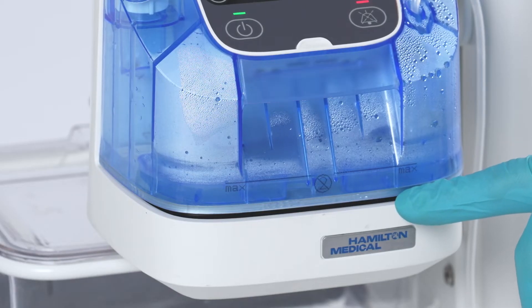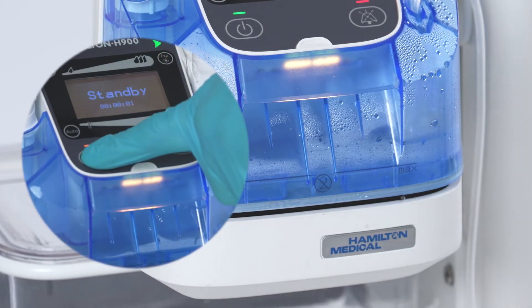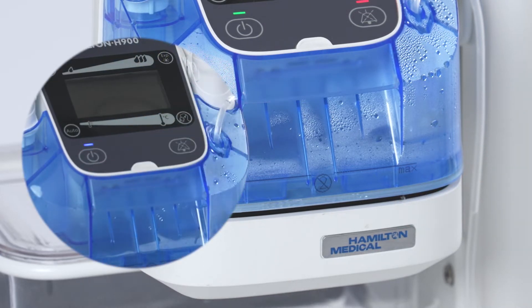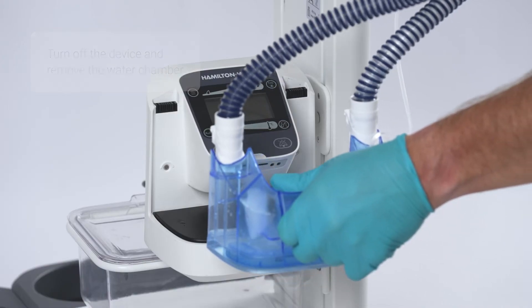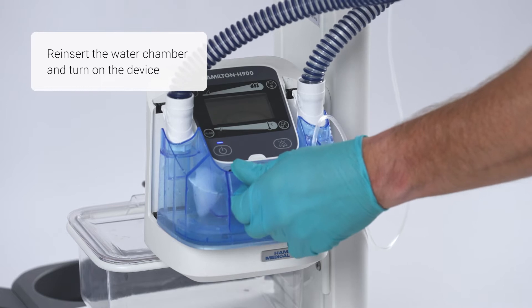If the water level is below the line, try to restart and reset the humidifier first. To do so, turn it off, remove the water chamber, slide the water chamber back in, and turn on the device.